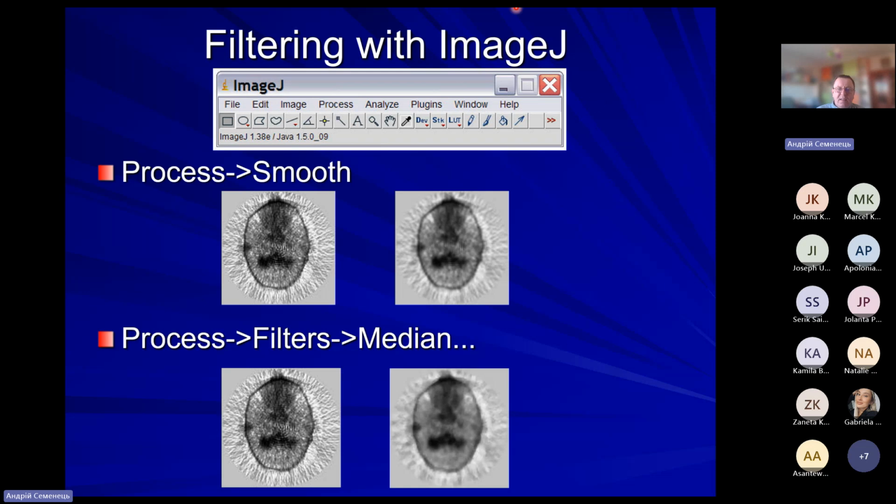One of the interesting things is ImageJ, a free open source project dedicated to manual or semi-manual processing, because it also contains things for automation, of medical images for deep analysis. Again, it's a tool for performing scientific analysis of medical images. What it actually does is replace all these mathematical formulas with conventional commands that a physician, rather a medical scientist, has no need to learn.